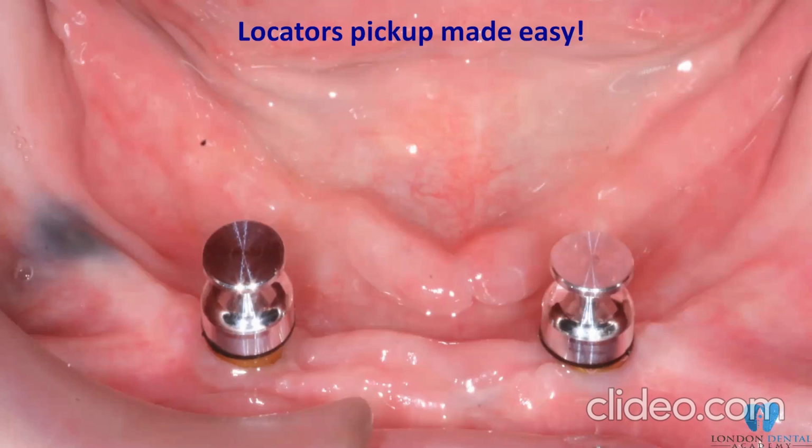So wherever you go, if some patients come through the doors, I can amend, repair and troubleshoot the denture on the same day, on the consultation day, either changing the insert, changing the abutment, or probably changing the size of the abutment. It depends on the case. So try not to complicate things for yourselves and for your patient, rather have a standard system to use in your practice.